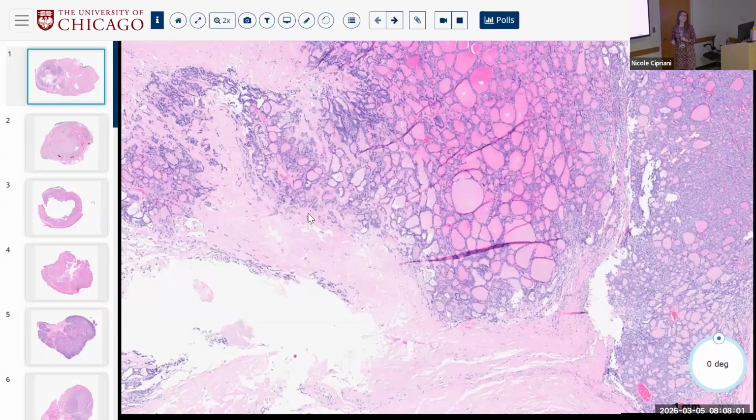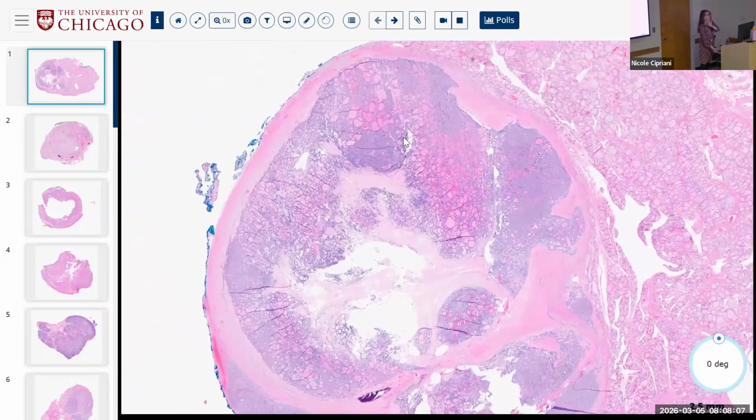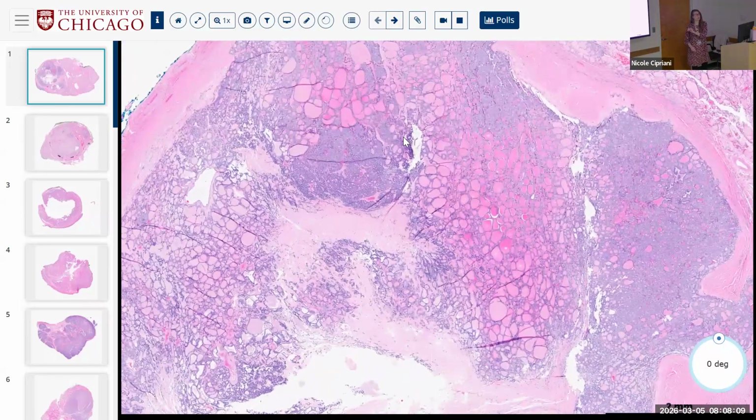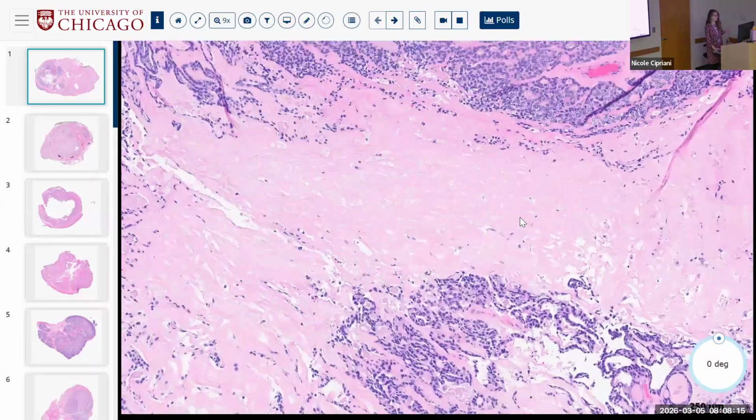Those are the essentials, right? So mitosis and necrosis, and we'll talk about criteria for high grade exactly. However, once you get to cancer, then you have to ask yourself if it's high grade. So high grade being true tumor necrosis and/or mitoses.